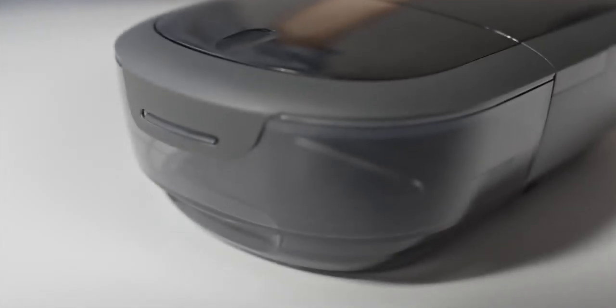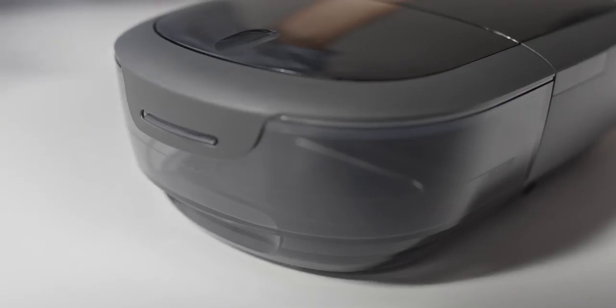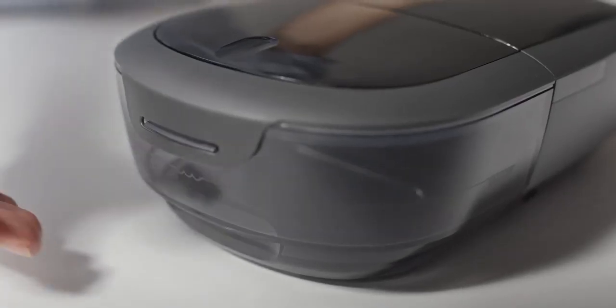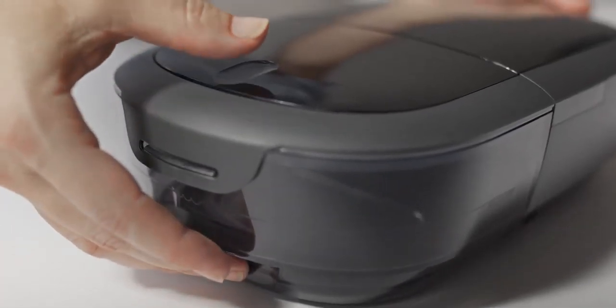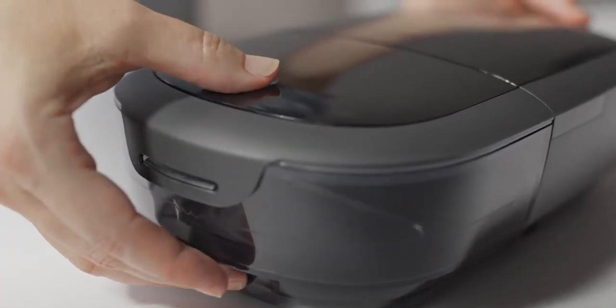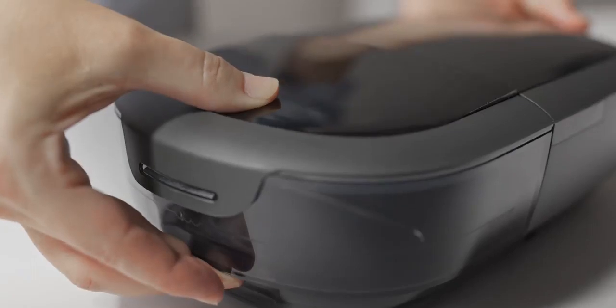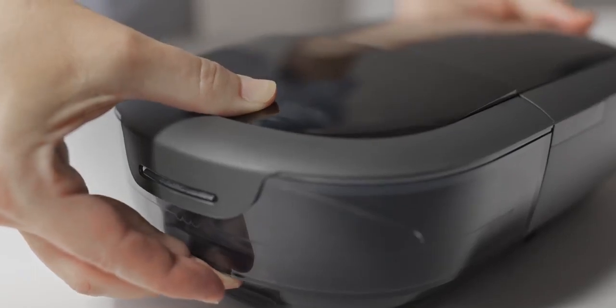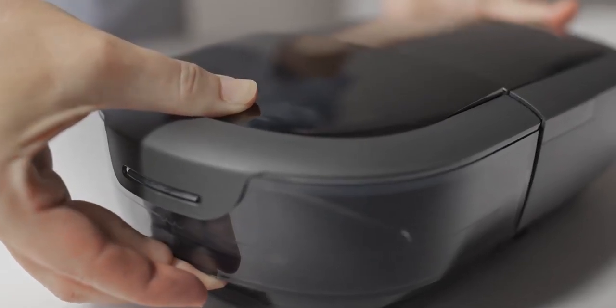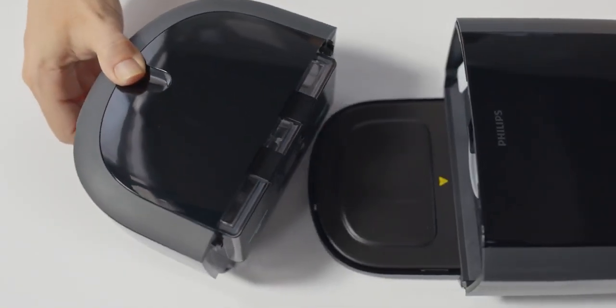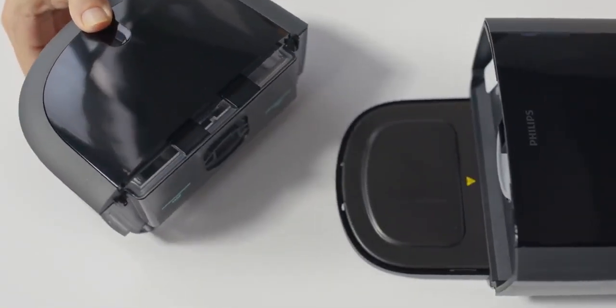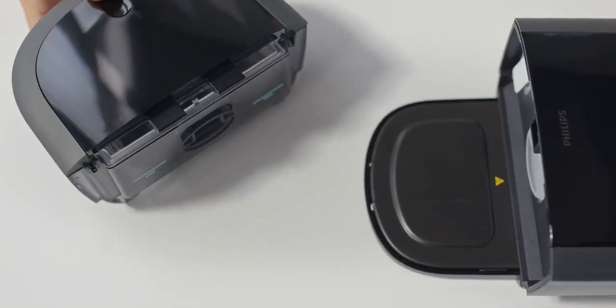If you're using humidification, remove the water tank by gently pressing down on the indent with your thumb to unlatch it. Holding the top and bottom, slide out the water tank. Set it on a firm flat surface.